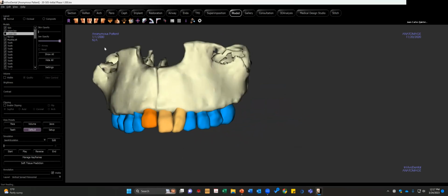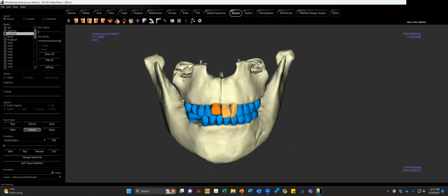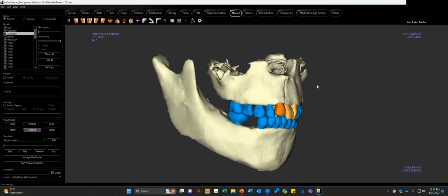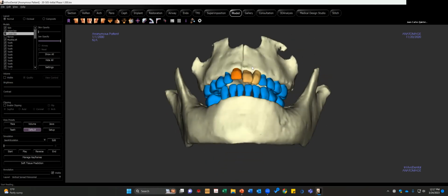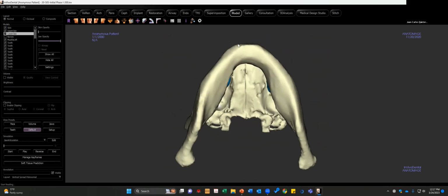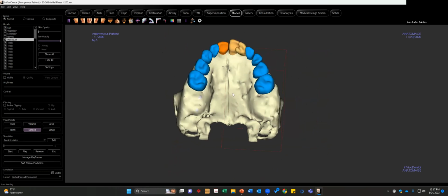One of the things that I get on our Anatomodels, and I believe that this is not an extra cost, but this is an evolution of the Invivo model. It wasn't always like this, but we've been able to now make it standard that I want the condyles, I want the joints, and I want the palate, nasal floor with the maxillary suture present so that I can simulate some of these movements, right?